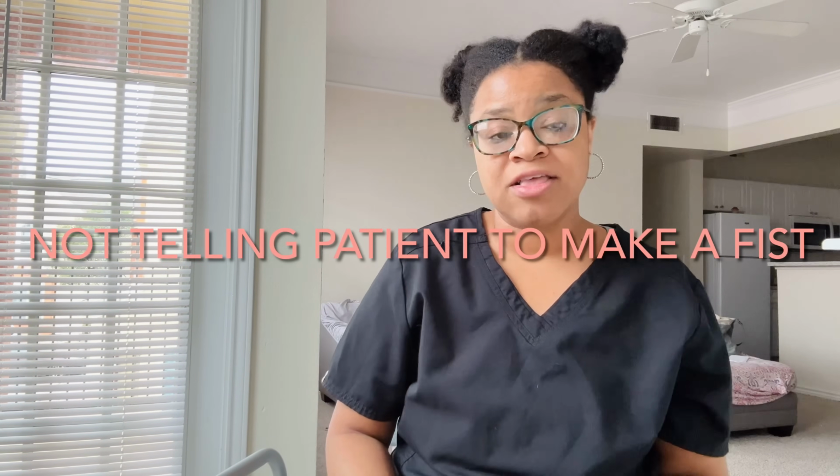Next on our list is not telling your patient to make a fist. Normally when you place the tourniquet on, you automatically tell them, if you can, please make a fist. This is just going to help the veins distend because it's restricting a little bit, which makes the veins come up. Some people who have really nice juicy veins, you'll see it as soon as you put the tourniquet on, or you may even see it before you put on the tourniquet. But for the ones that you cannot directly see, tell the patient to make a fist. And then once you have successfully got into the vein with the needle, you will tell the patient to relax their hand.